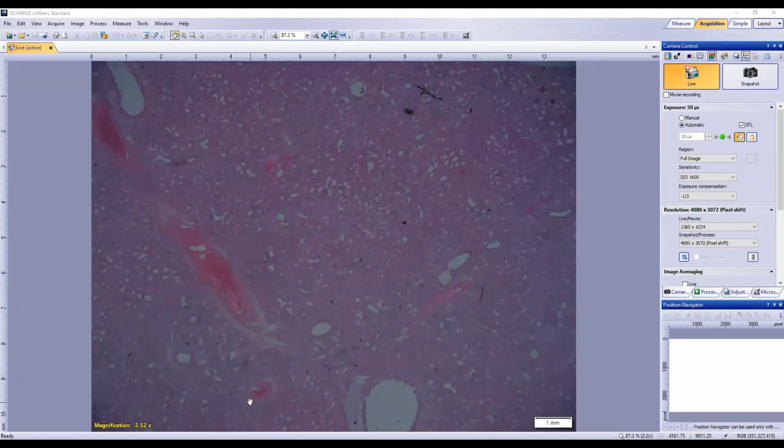Absolutely. So why is it so important in this particular case that we would be looking for hyaline membranes or not? I guess it may contribute to your final etiological diagnosis. Yeah, yep. And what I'm getting at, hyaline membranes, do you see a prognosis potentially? Yeah, you're absolutely right, Stephen. And certainly, if the entire lung looks like this, then we can see why the animals ended up on our microscope stage.